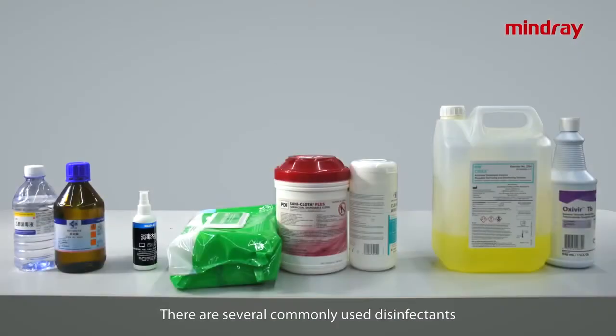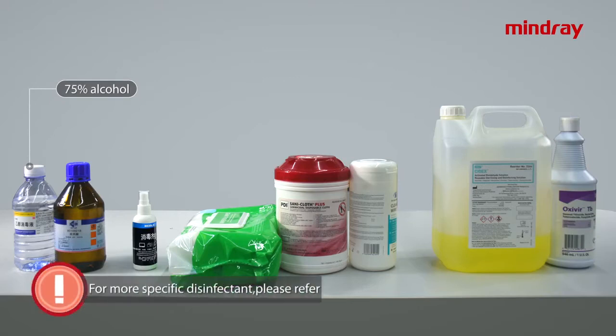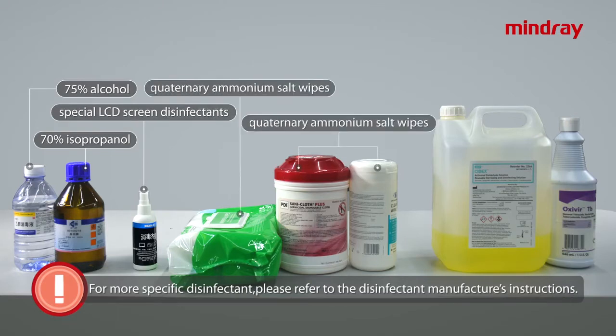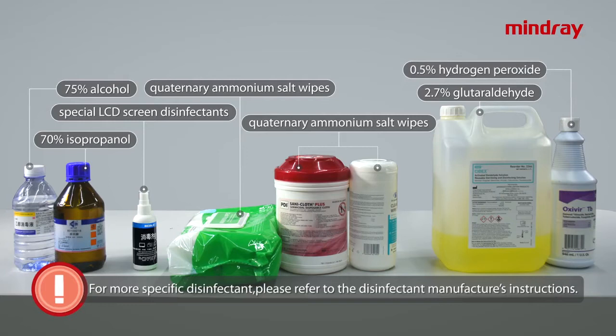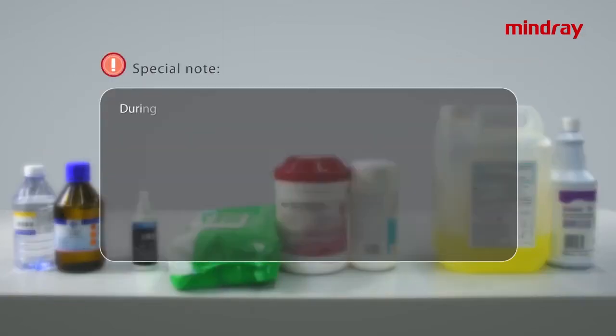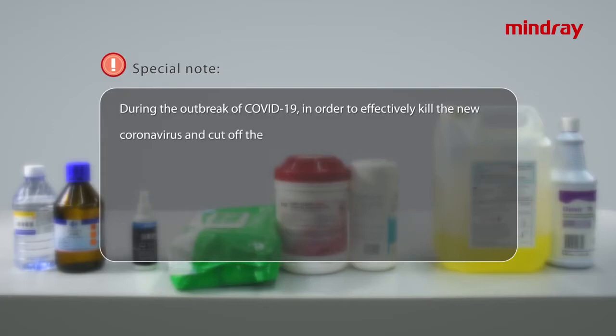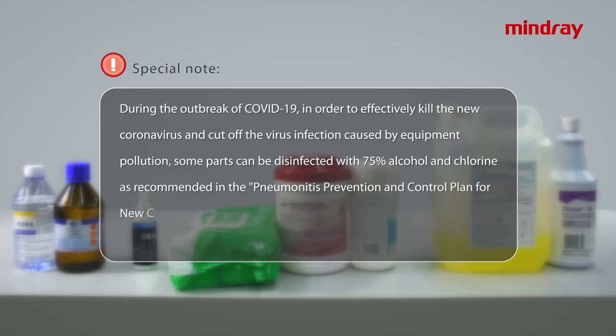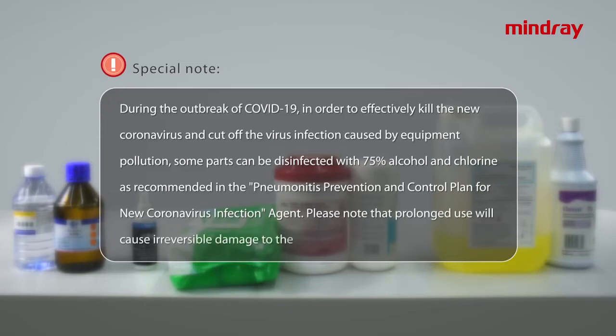There are several commonly used disinfectants: 75% alcohol, 70% isopropanol, special LCD screen disinfectants, quaternary ammonium salt wipes, 2.7% glutaraldehyde, 0.5% hydrogen peroxide. Special note: during the outbreak of COVID-19, in order to effectively kill the new coronavirus and cut off the virus infection caused by equipment pollution, some parts can be disinfected with 75% alcohol and chlorine as recommended in the pneumonia prevention and control plan for new coronavirus infection. Please note that prolonged use will cause irreversible damage to the equipment.